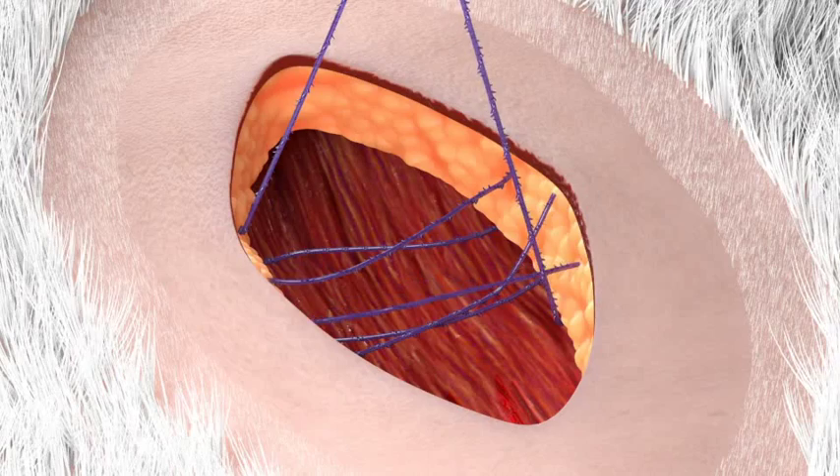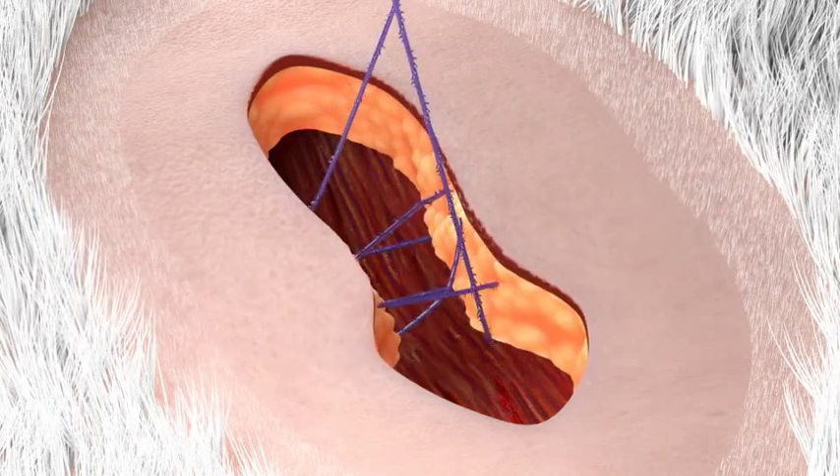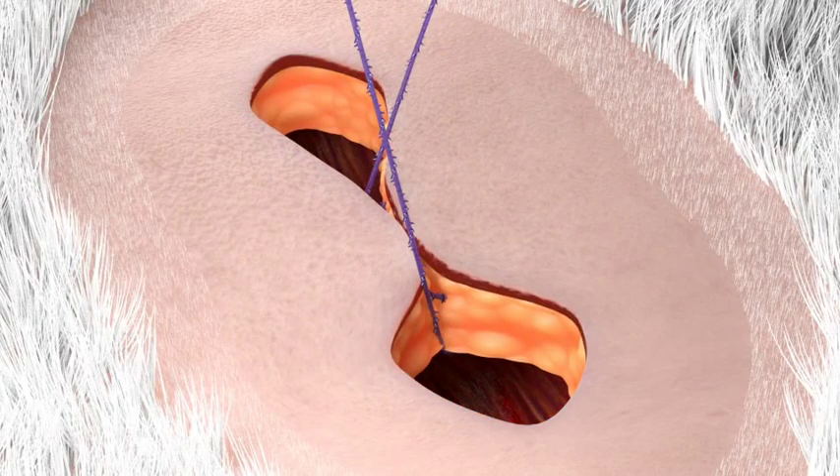Next, grasp both arms and cinch, approximating the tissue to the desired tension. This anchors the quill device.